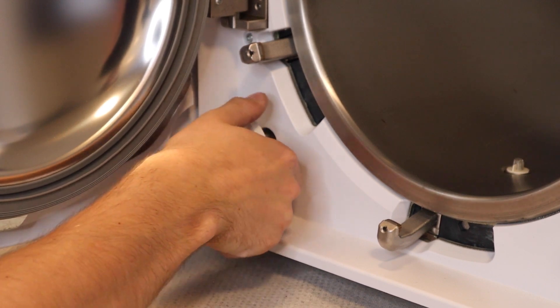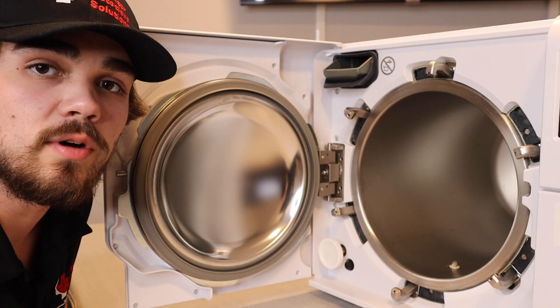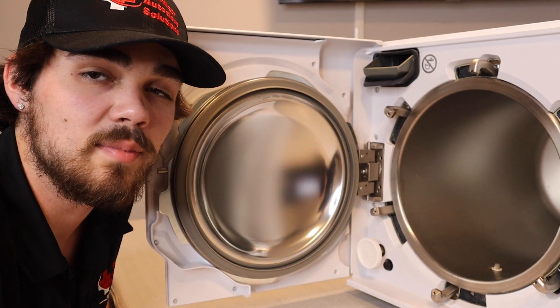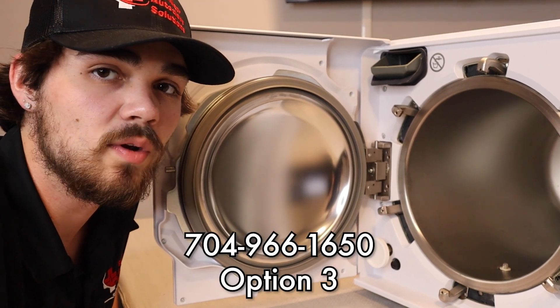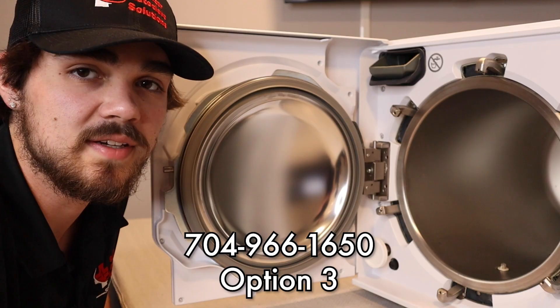There should be no excruciating amount of force put onto this HEPA filter — just hand-tight works. If you have any questions with the installation of the HEPA filter, please give us a call at 704-966-1650. Option 3 will bring you to tech support.